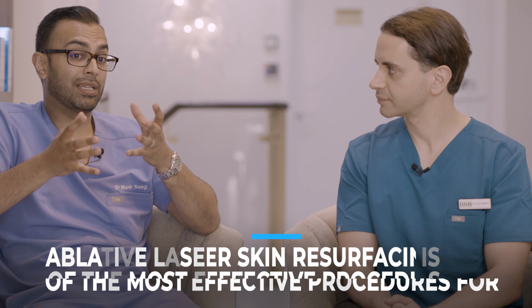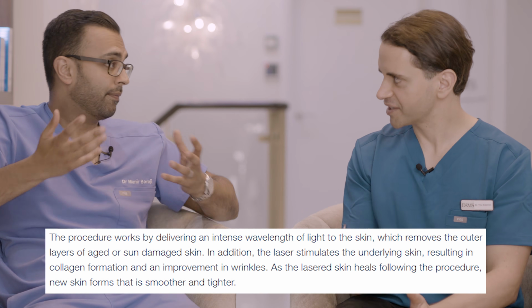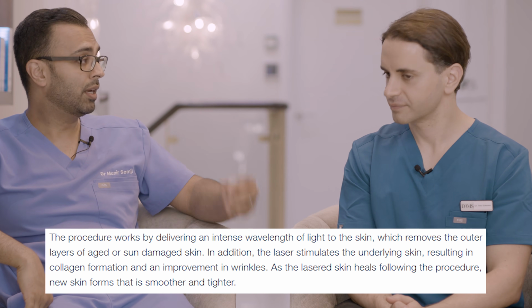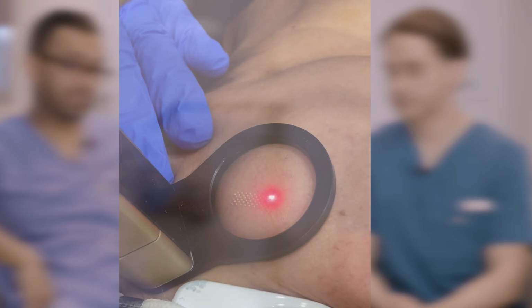So ablation means that that outer layer of the skin is basically taken away. So you're essentially cutting the skin. Yeah, you can smell it. Obviously, we use a vacuum and things like that, so you don't smell it during the procedure, but you can smell it. That outer layer of the skin has basically been burnt away, selectively burnt away.